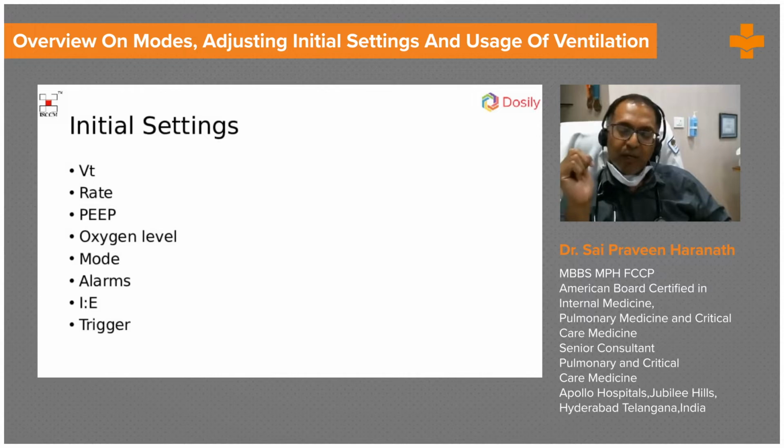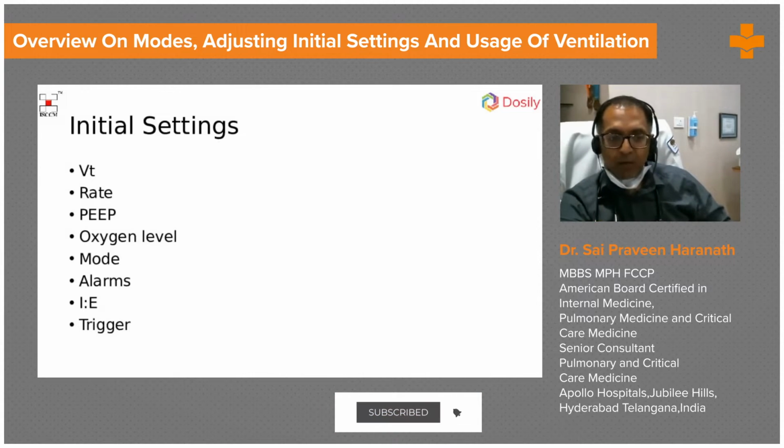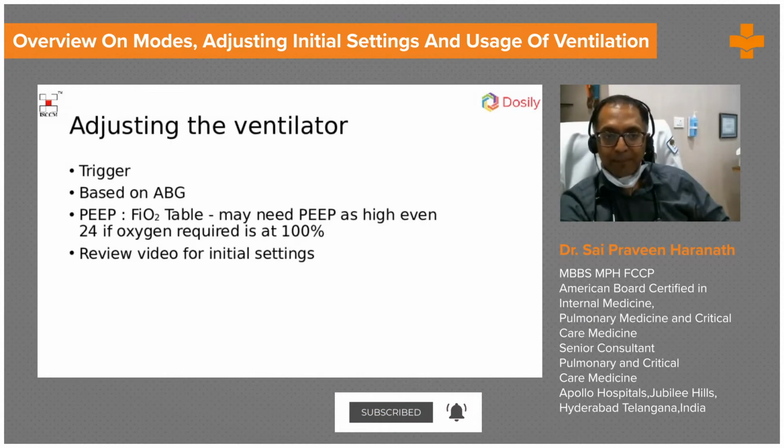But you can change that. You can make the air get in faster. So you can make it 1:3, where out of those 3 seconds, you give more time for the air to go out. And that can be important in somebody whose carbon dioxide is high, where you want to ensure the carbon dioxide actually comes out over a longer duration of time.